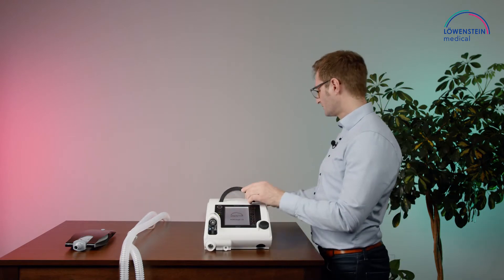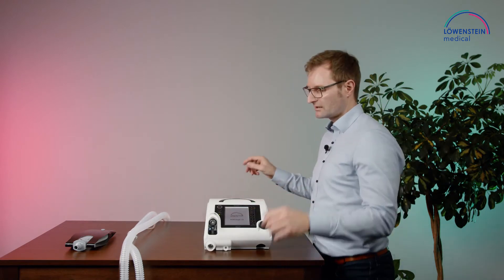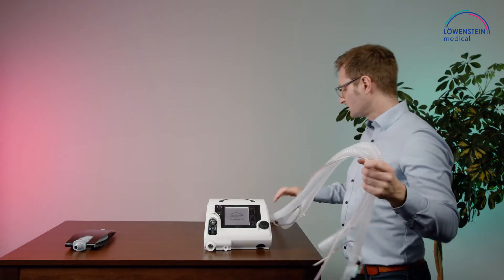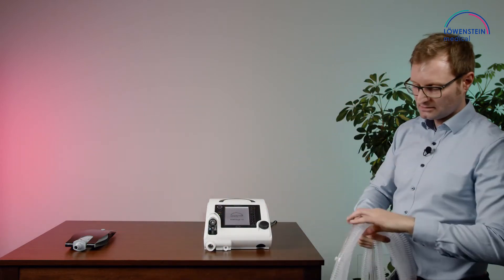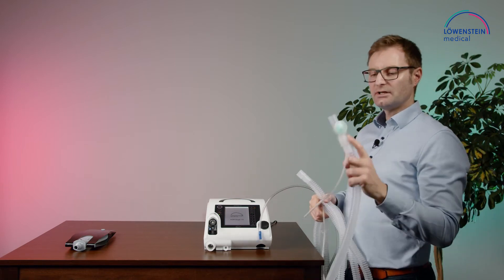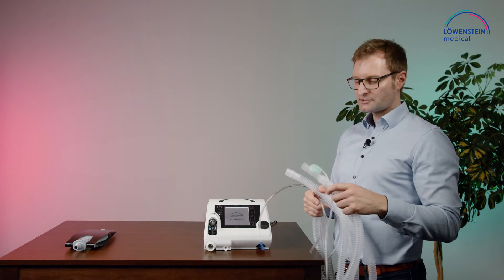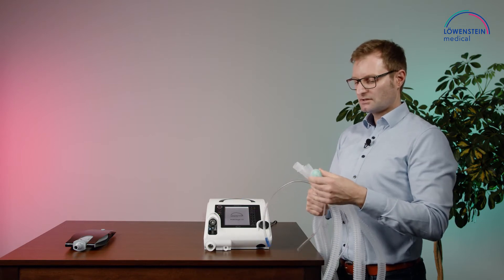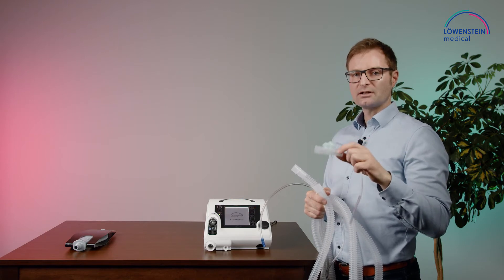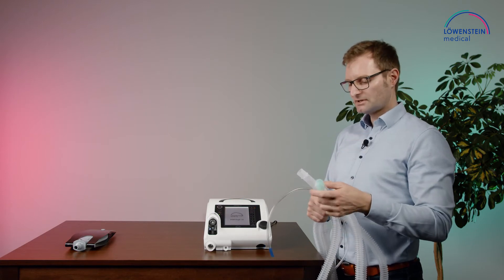Now we can connect the circuit. In the double circuit delivered together with the device, the exhalation valve is already installed on the circuit. If you use other circuits like heated circuits, you can order these valves separately.